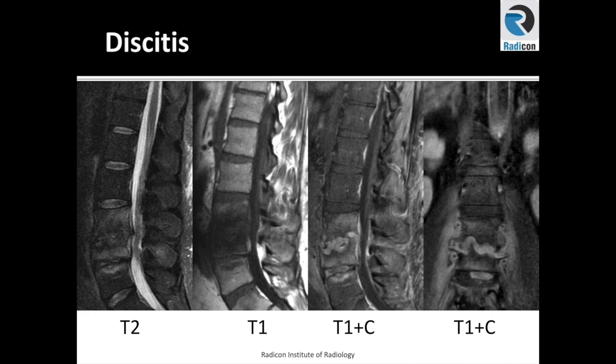On the right side, post-contrast images in sagittal and coronal planes demonstrate significant post-contrast enhancement in the disc, as well as suggestion of epidural enhancing tissue and epidural abscess. Further, you can see enhancement going into both psoas abscesses bilaterally. This is a case of L3-L4 discitis.